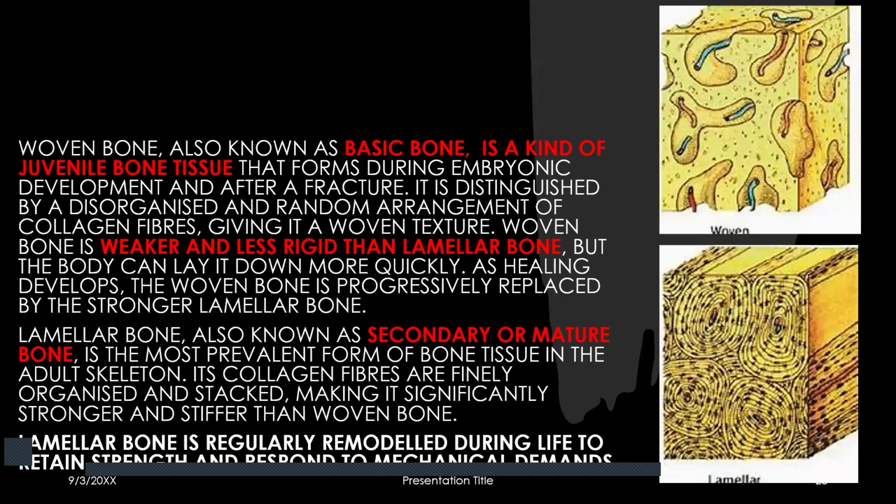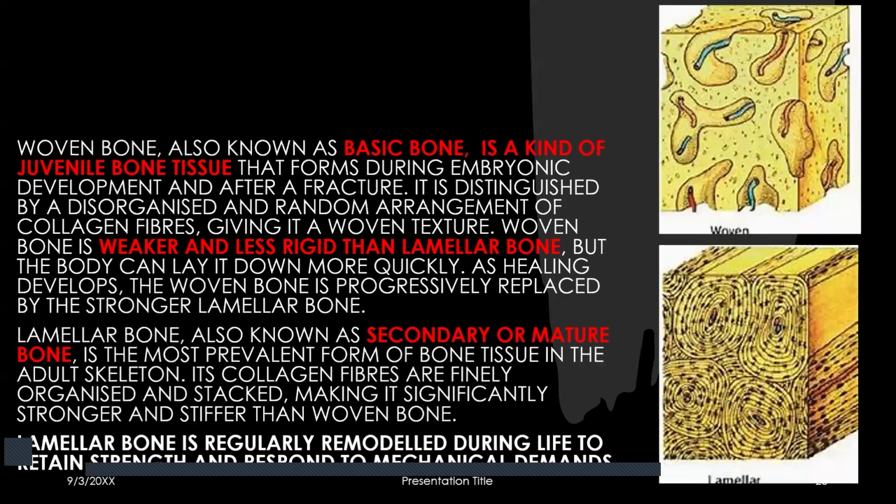If you miss one step where the primary healing will happen, then the implant will go into failure. That is one of the biggest reasons for the failure of the cortical implants.